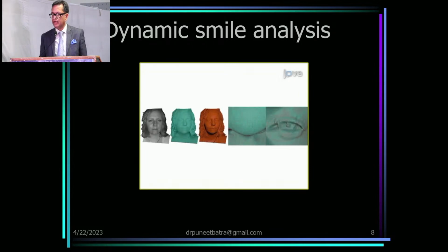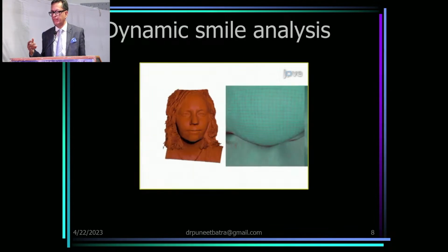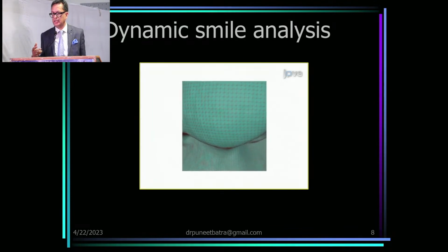Electronic models are changing the way you archive models. So you do not need the dental casts. You can actually archive them on a 3D scale.